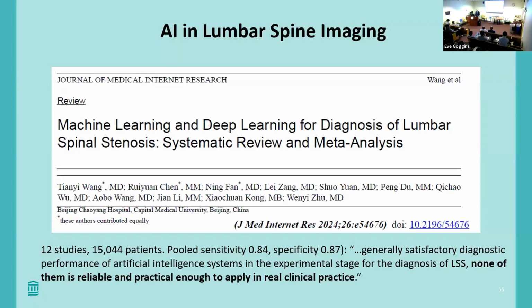And I'm just curious, is it even getting close enough where somebody could be presented with an editable report that even if it's way off, still gives you a good starting place? I think so, yeah. But again, in that edge case, like the don't be a robot example, it might give you kind of a garbage report saying mild this, mild that, that would be correct, but not clinically helpful in that situation. But you're not even using anything operational yet? Correct, we use nothing.